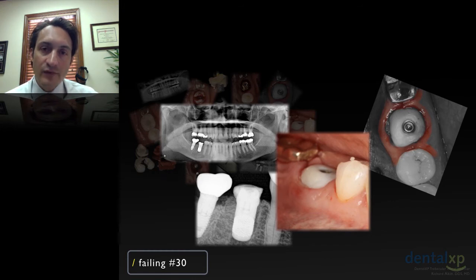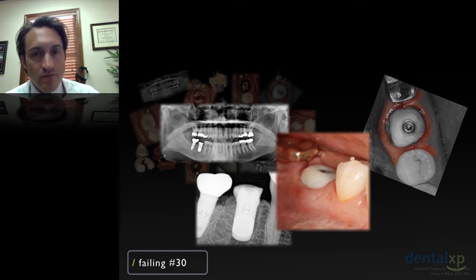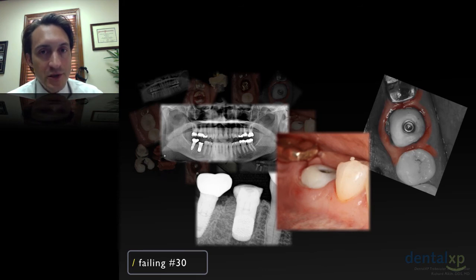I've seen these when I have provisionalized molars. I see very little changes along the buccal for whatever reason. Maybe there's graft incorporation into the gingiva. Maybe it allows for the support of the gingiva during the healing phase, so there's less scar contracture. Whatever it may be, this allows for a much more anatomic final impression and what I would consider a better long-term anatomy in the area.